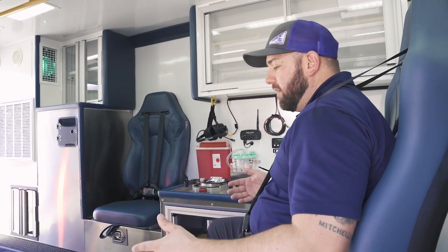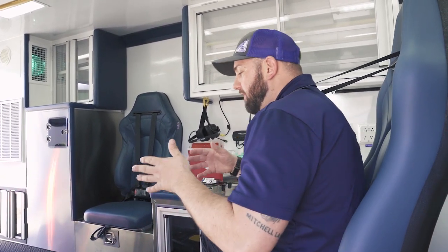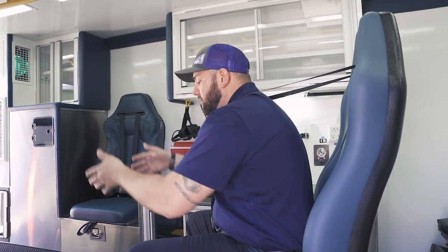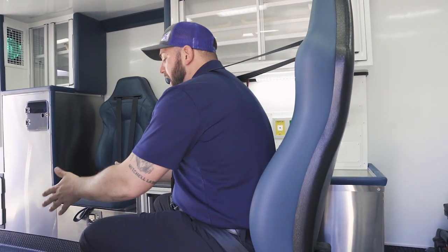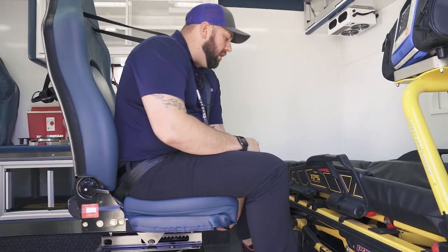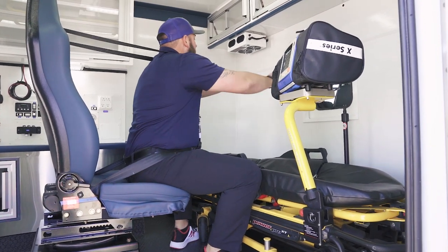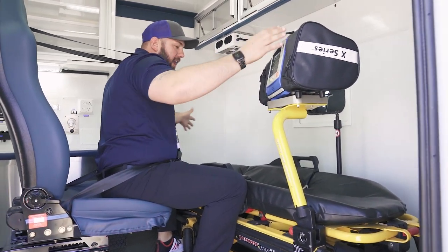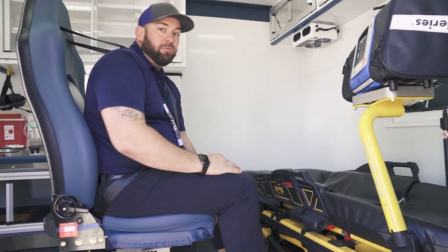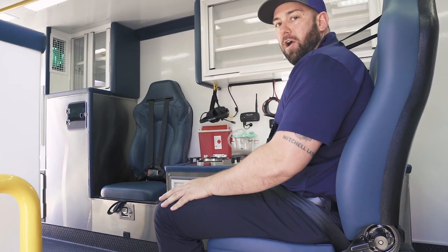Part of the design requirements: Floyd wanted this chair located so that if they were transporting just a patient — not in an isolate — they could still work from the head, but also when they do have an isolate loaded, the critical care nurse or neonate nurse can slide the chair forward and has access right here to everything they might need. When they came in and saw the unit, sat in the chair, and swiveled around, they were blown away — perfect location, knocked it out of the park.